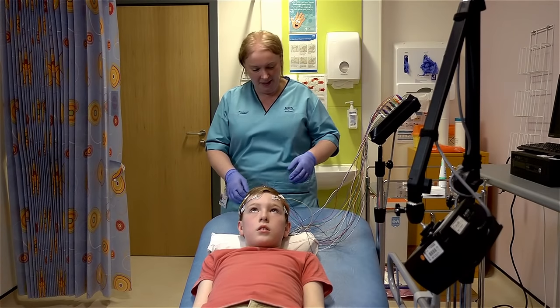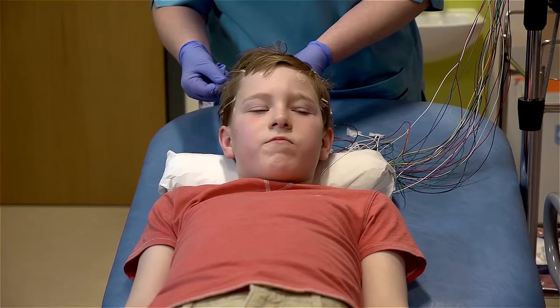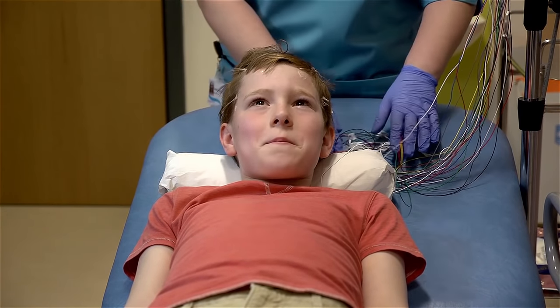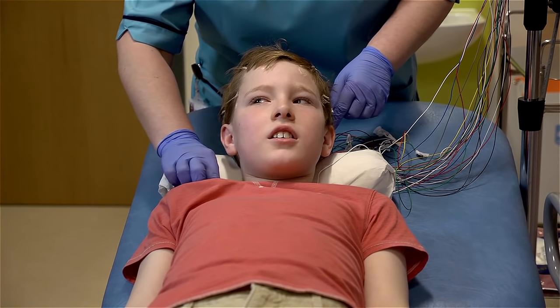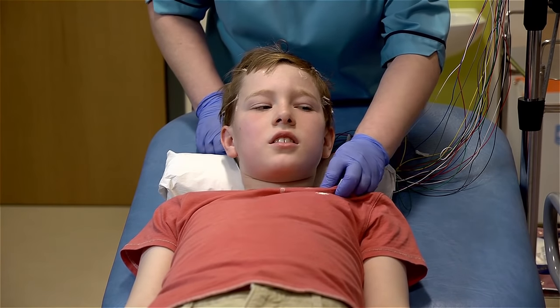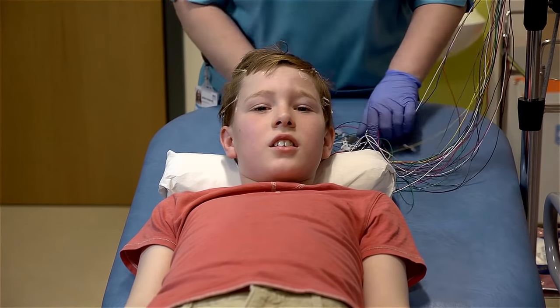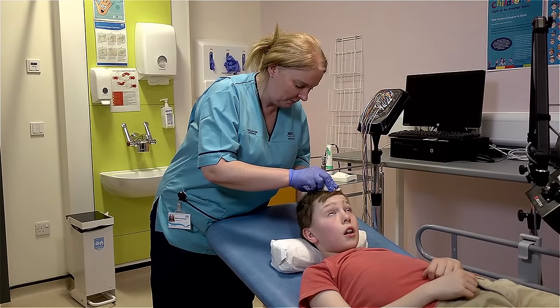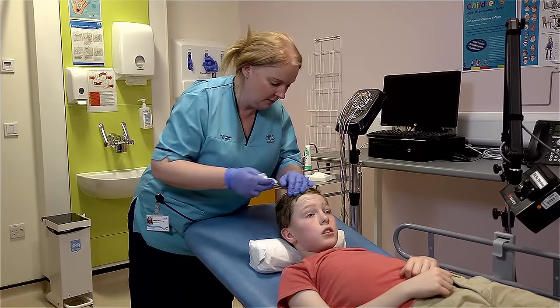Okay Robert, that's us all done. I'm going to get all these off your head now. Can I get your hair cleaned up before you go? Just pull the hair a little bit, but we're nearly done. I'm going to take the two off your shoulders now. That's them all off. So I'm just going to wash your hair up and that'll be you. And that's that all done.